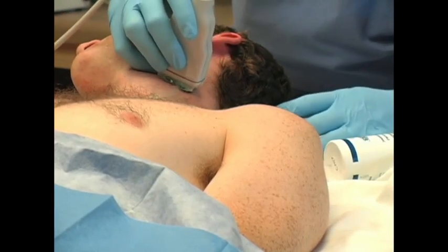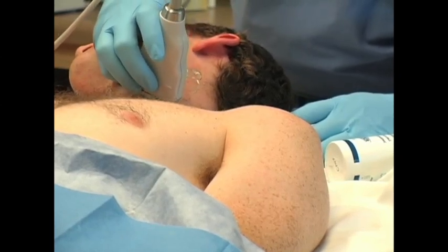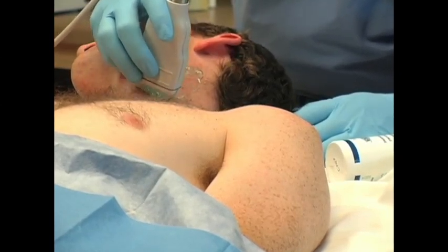Traditionally, the right IJ is preferred. However, if it's very small, we may actually use the left internal jugular vein to place our line.